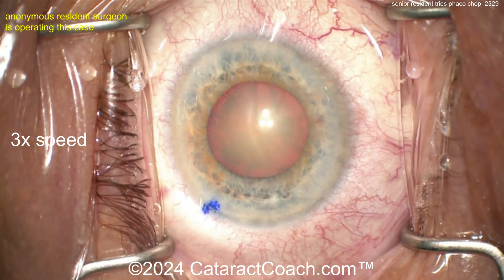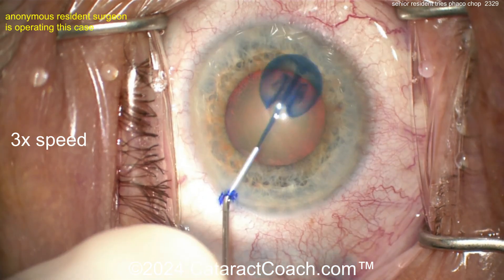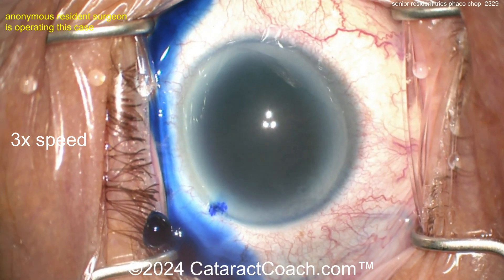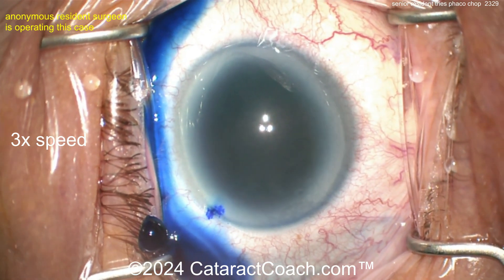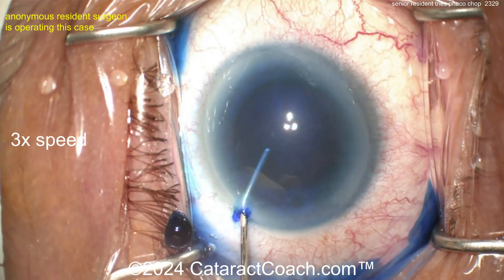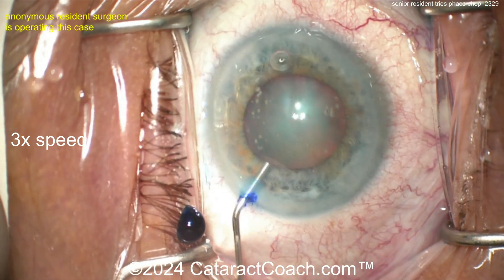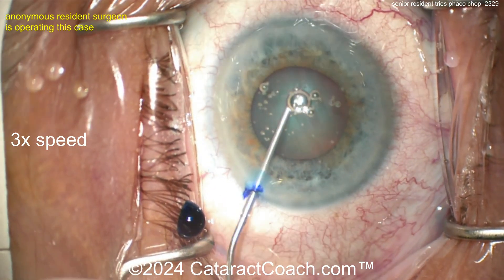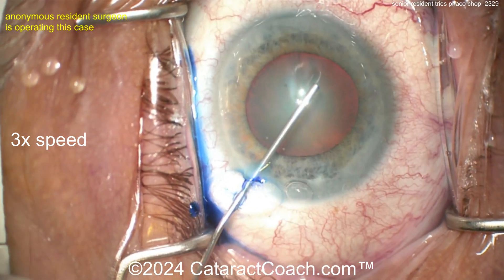Lashes out of the way, lid margin sequestered — I like it. Now trypan blue dye going in to stain the anterior lens capsule. Keep in mind that trypan blue dye also makes the lens capsule a little less elastic. Diluting that down with some BSS. Not quite a total white cataract but there's a good amount of density here, and now the dispersive viscoelastic agent going inside the eye.